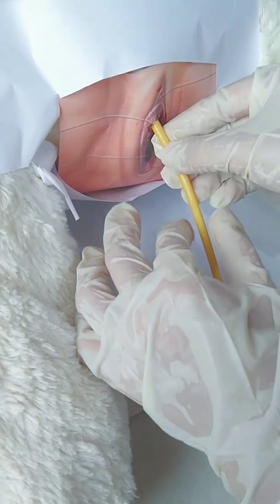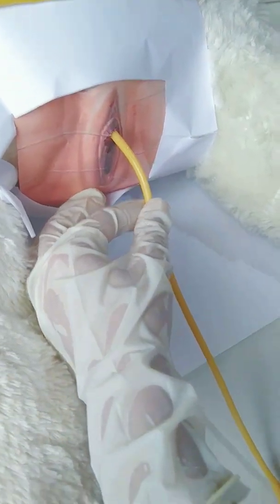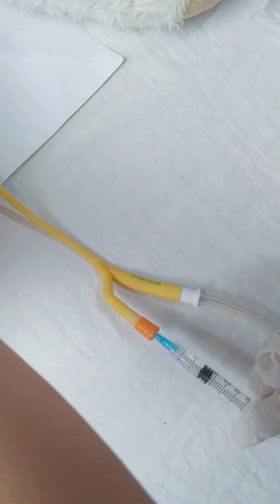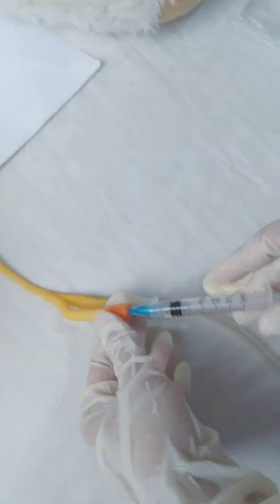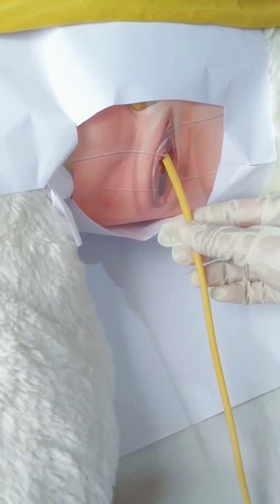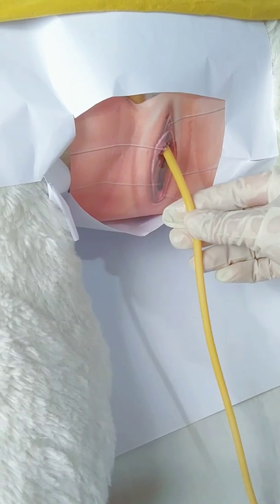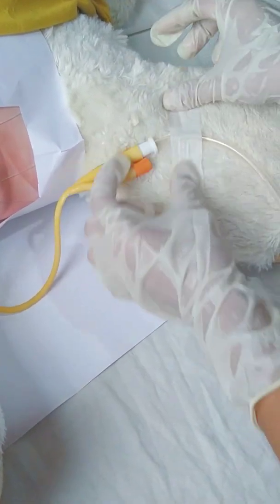Hold the catheter with the non-dominant hand, then use the sterile dominant hand to fully inflate the catheter balloon. Then remove the syringe. Gently pull the catheter until resistance is felt. So it is already resistant. Secure the catheter on the patient's inner thigh with a securement device. Secure it so that the patient will be comfortable.